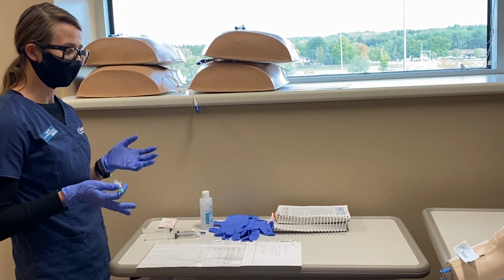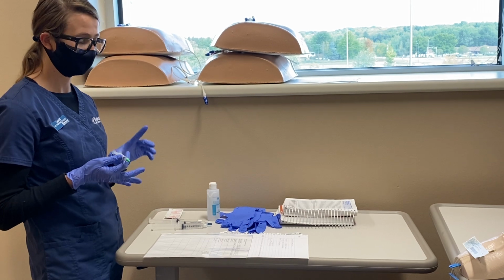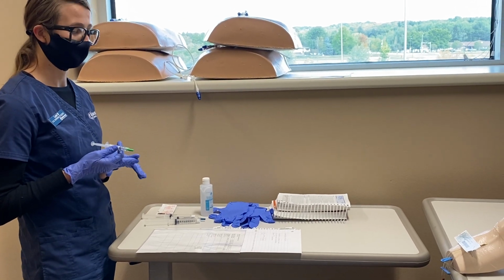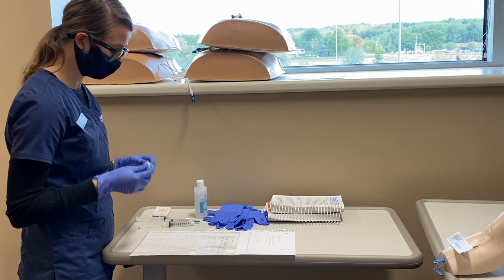After I give this, we're going to watch for any adverse reactions. Some adverse reactions may be respiratory depression, hypotension, or apnea. So I want you to let me know if you feel any of that after I administer it.